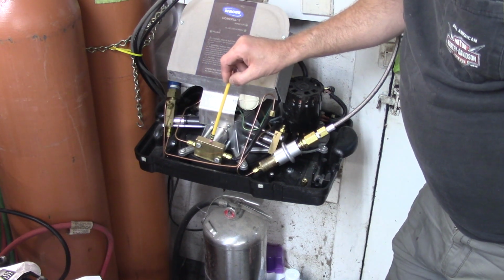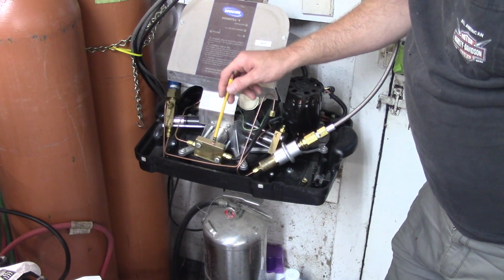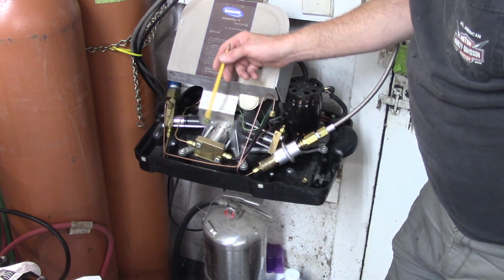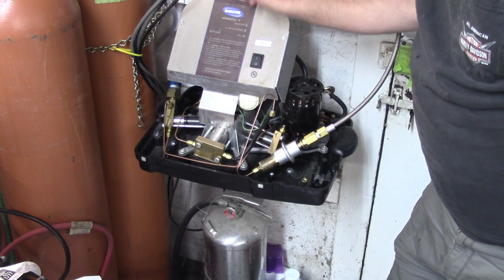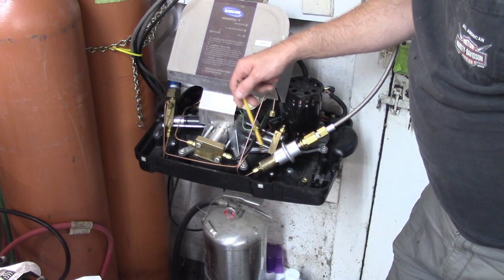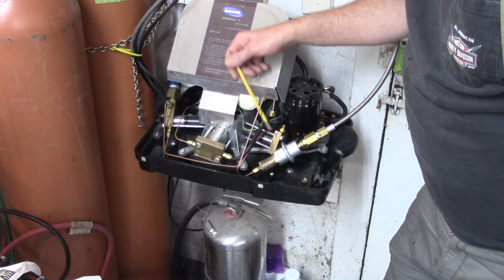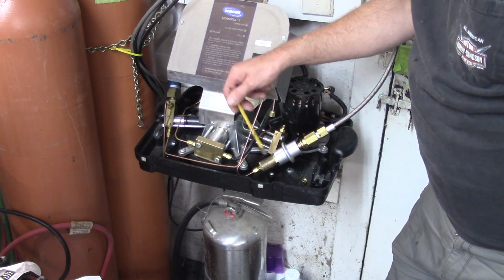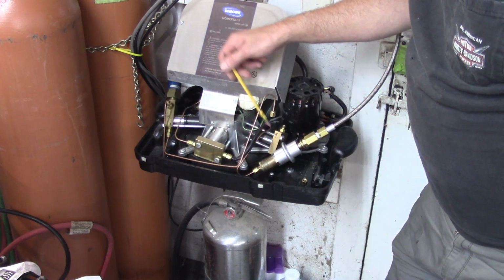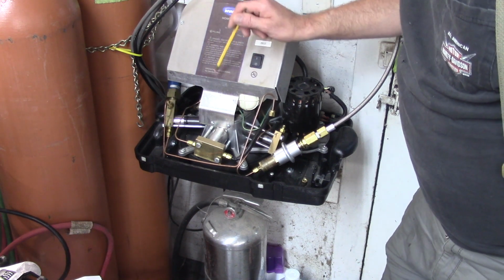Inside of the cylinder head here is a one-way check valve. I've seen a couple people beat on these things because they say the check valves are clogged. Check valves generally don't clog. They do, but in this particular case, mine were not clogged. I blew some relatively high pressure, only 150 psi, through the check valves, and it was moving air just fine one way and not the other, so therefore it's flowing the correct direction.